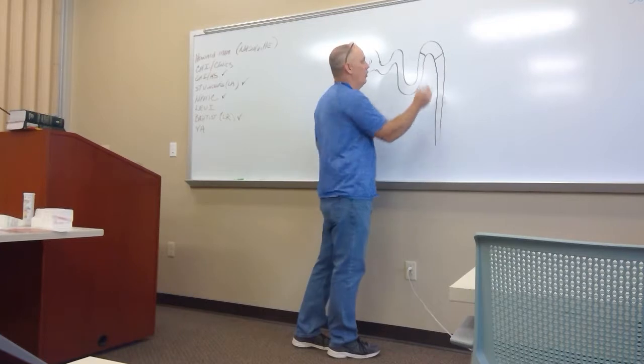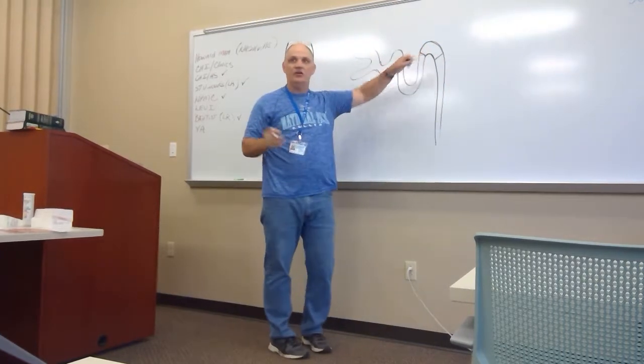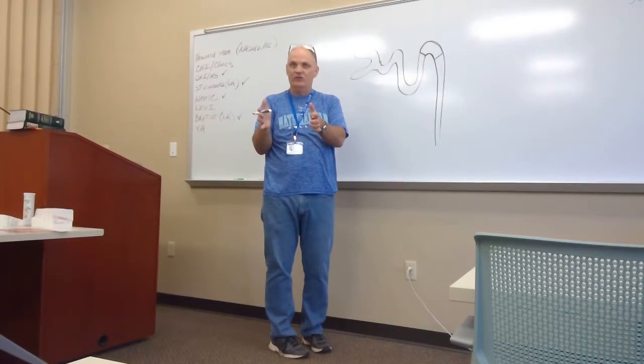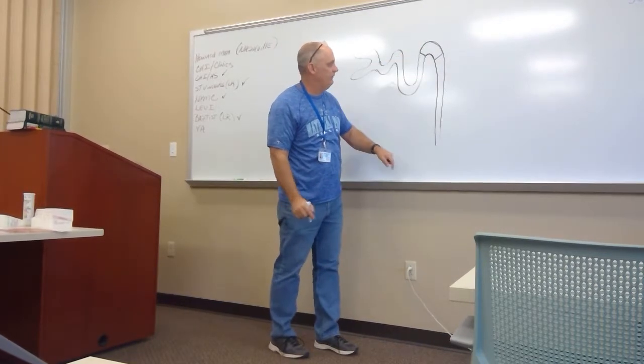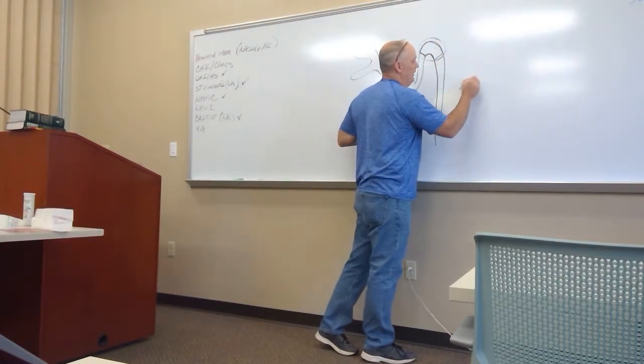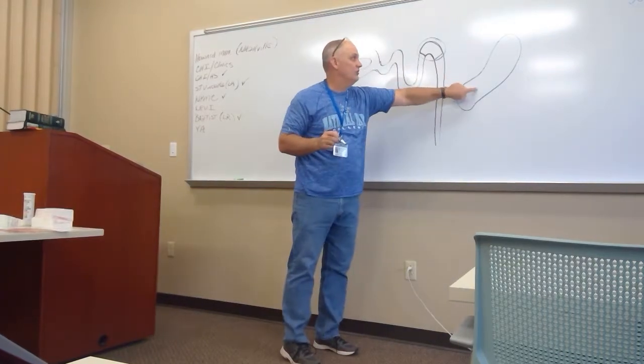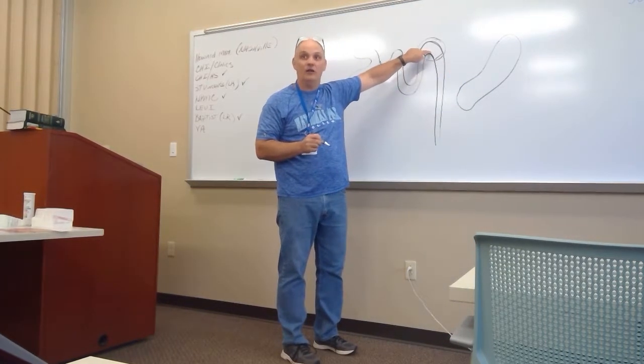See what I mean? It's like a large chunk of protein formed right there because the urine got kind of stagnated for a second. It breaks off, and when we see it in urine, what was right here ends up appearing as looking like this in the urine. In other words, it kind of represents how the tubule looks right there.